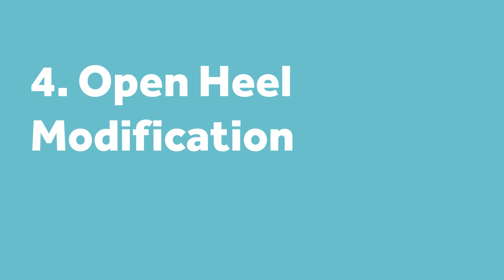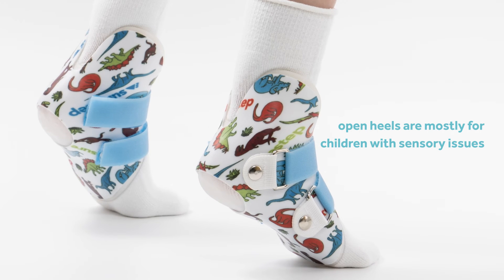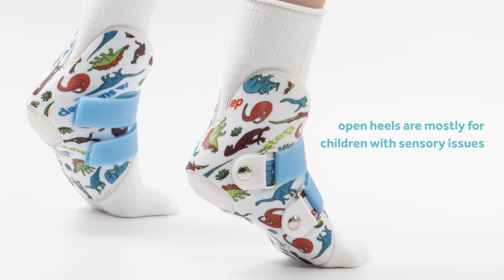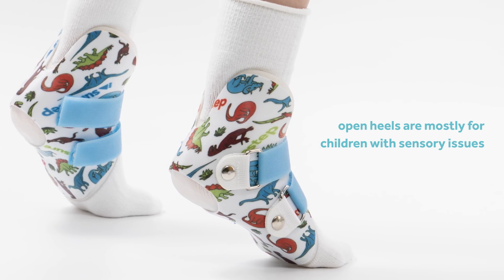The final modification is an open heel. Instead of putting a heel post, we cut out the heel, which gives compression of the tissue. It's often used for kids with sensory issues — we're trying to let them feel the heel. We also include an inner boot for comfort and to help with the overall integrity of the device. Those are the primary modifications for our standard SureStep SMO.